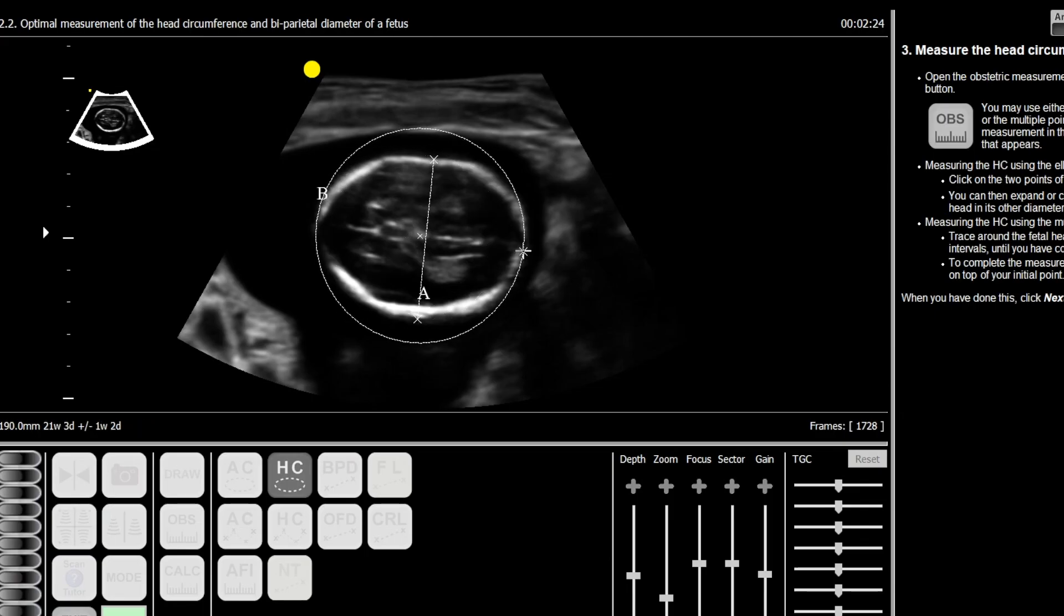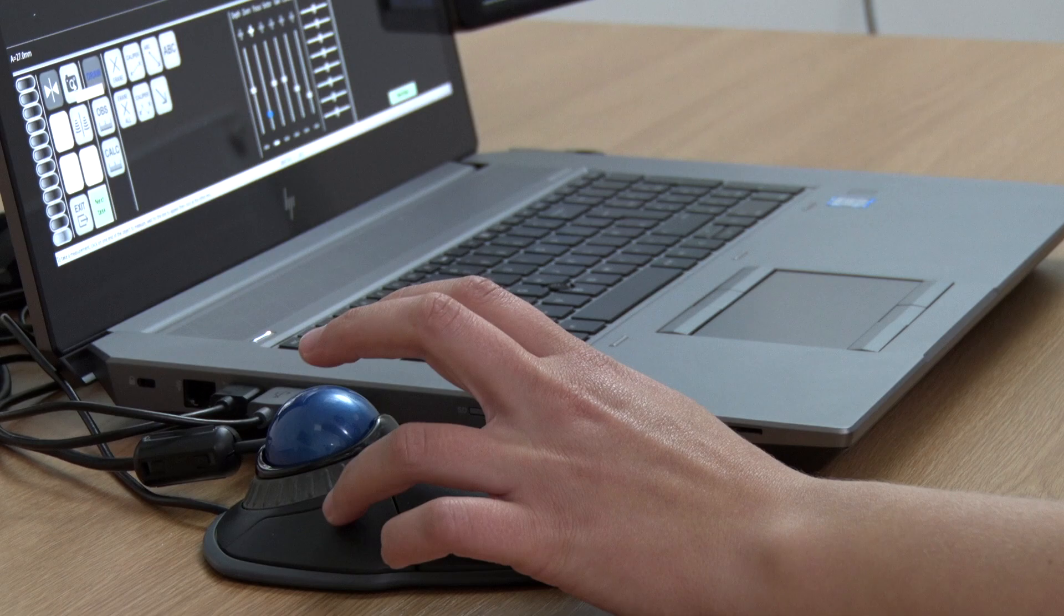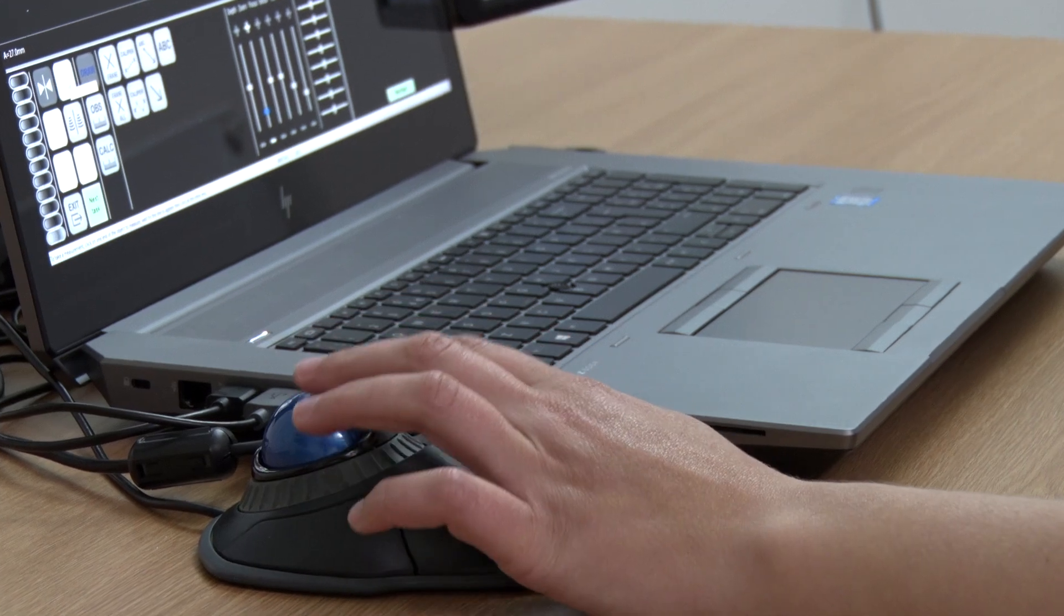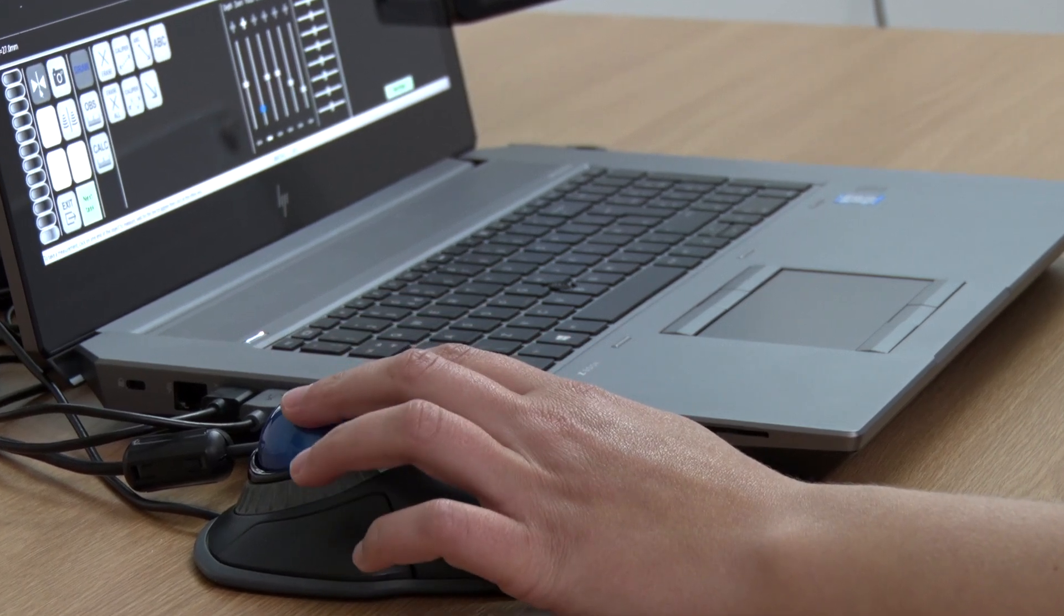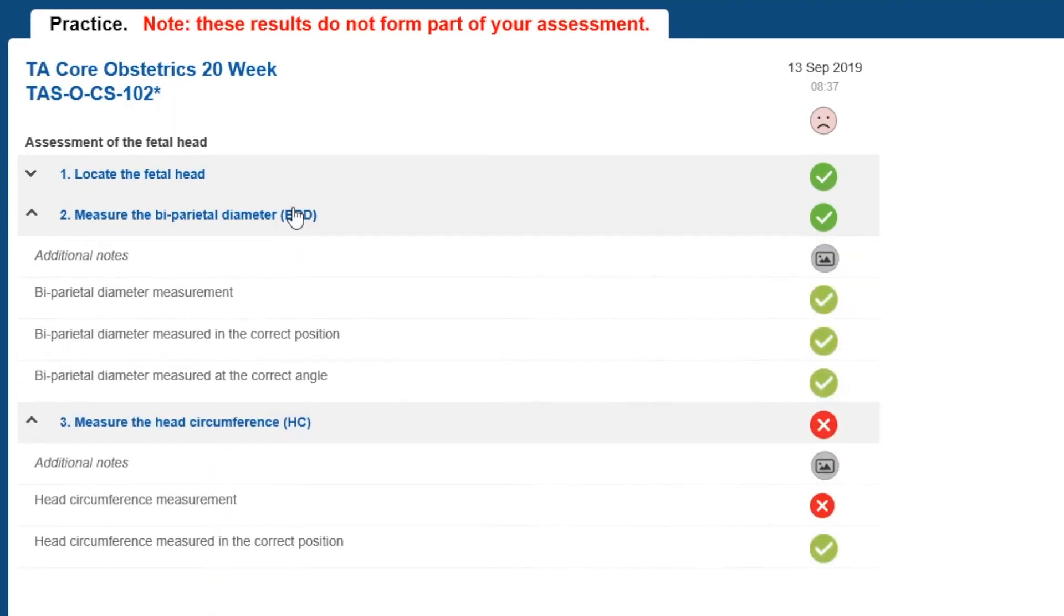After practicing each lesson with ScanTutor, trainees can take the exam where feedback is provided on all aspects of their performance.